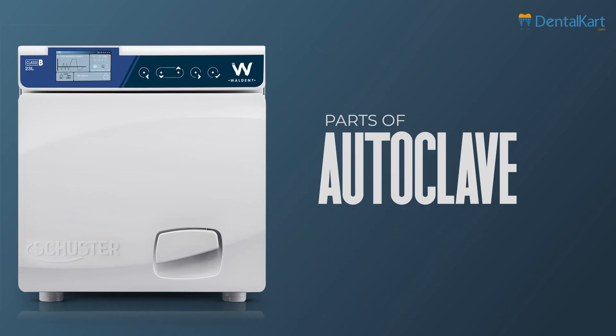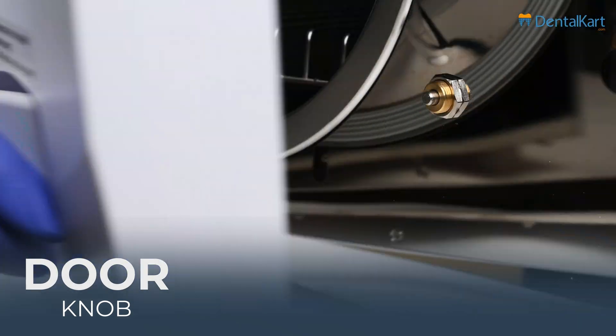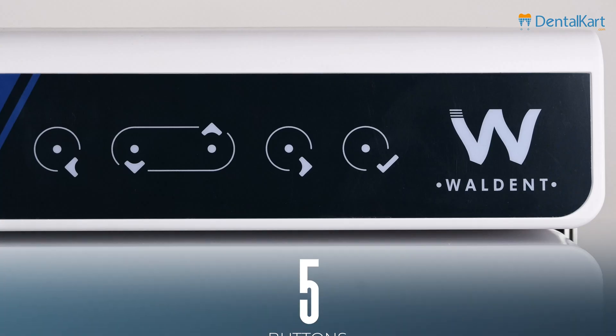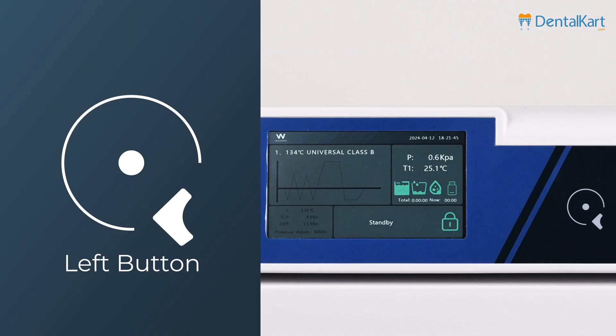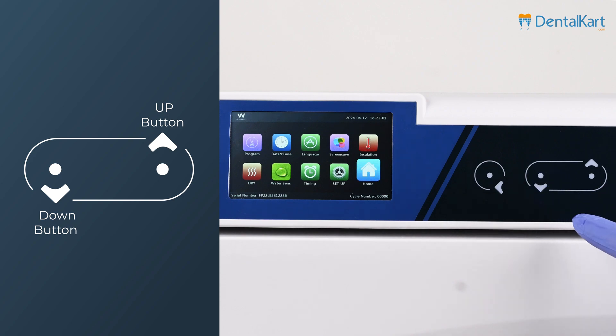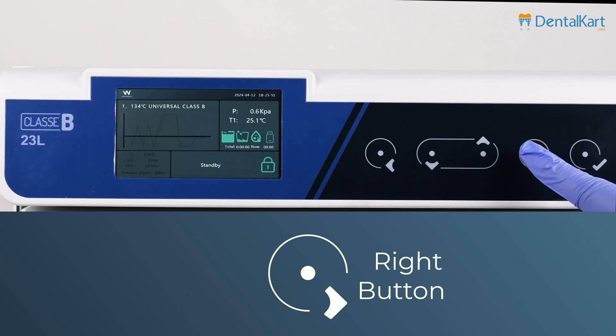Now we'll see the different parts of this autoclave. Starting from the front, we have the door knob and the control panel. On this side, there are 5 buttons: the left button which also serves as a menu button, the down button, and the up button.